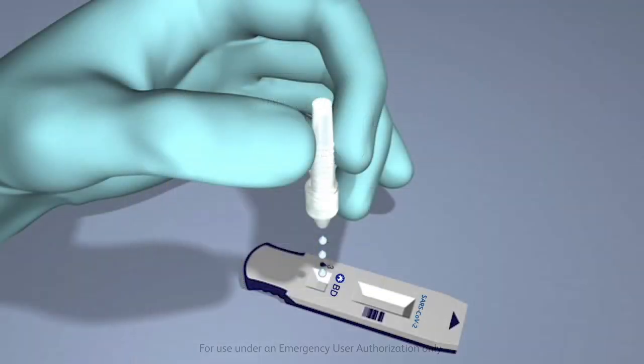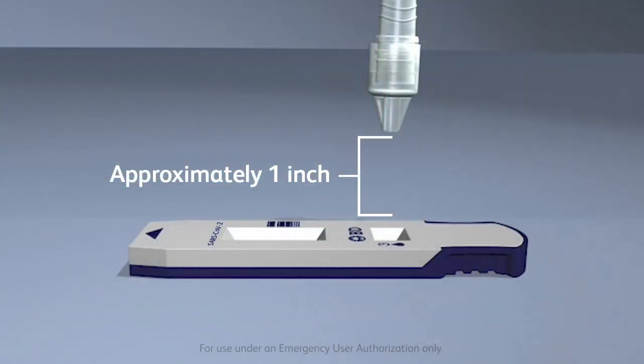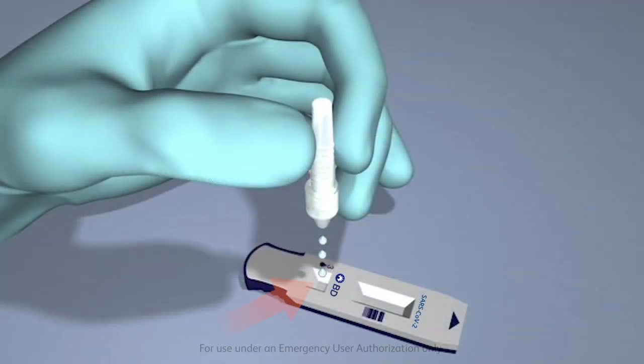To add the specimen, invert the tube and hold it vertically, approximately one inch above the sample well of the test device. The sample well is the small well next to the teardrop mark. Squeeze gently on the half of the tube furthest away from the tip, dispensing three drops of the specimen into the sample well of the properly labeled SARS-CoV-2 test device.